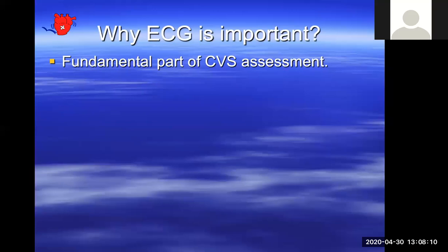So why is ECG important? It's a fundamental part of the cardiovascular assessment. Once you have taken a good history and a good examination, you formulate an idea about what's wrong with the patient, and you have to do tests. One of the cardiac tests, almost for everyone with a cardiac problem, even a non-cardiac problem or preoperatively, is an ECG. So it's an essential part.